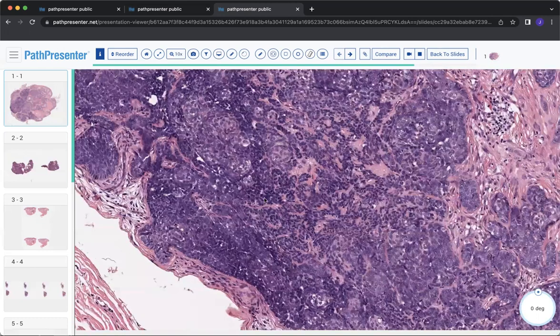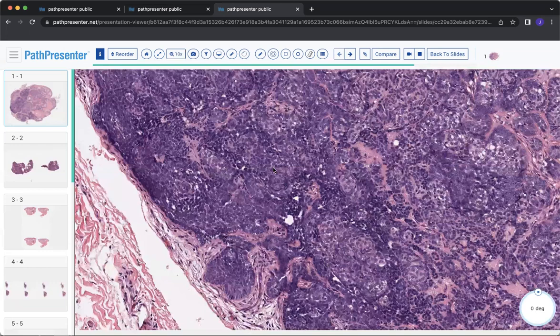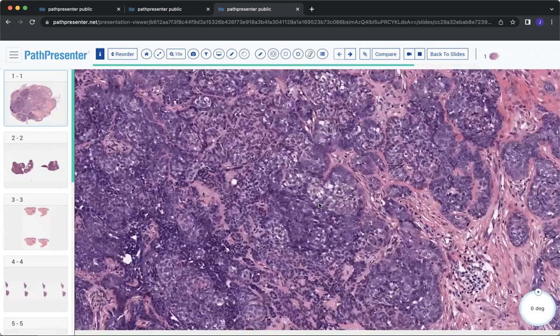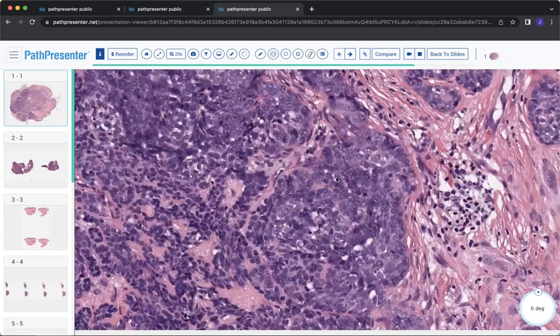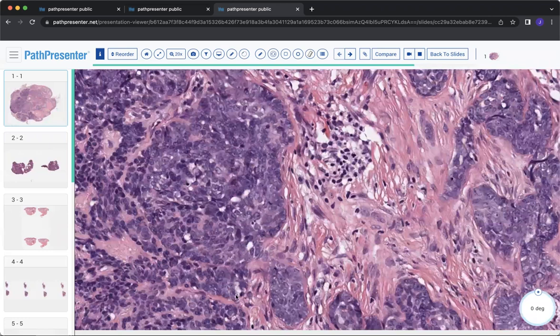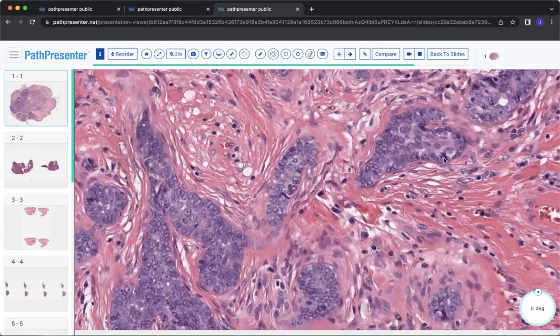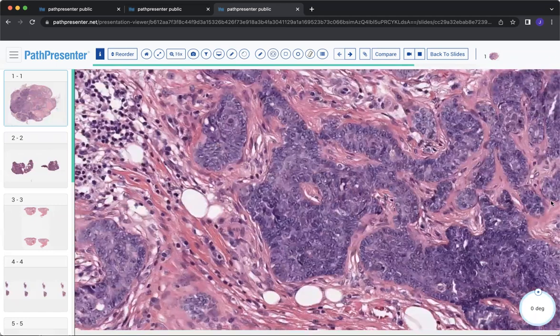And you just have to take clinical scenario into consideration as well. Now, the differential diagnosis in this would include obviously a basal cell. You might find some little vacuoles in here, so you might consider some type of sebaceous carcinoma and do an adipofilin to make sure this thing is not having significant areas of sebaceous differentiation.